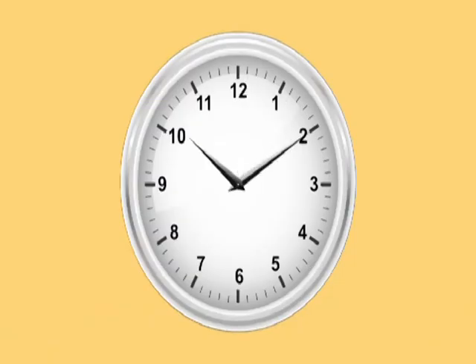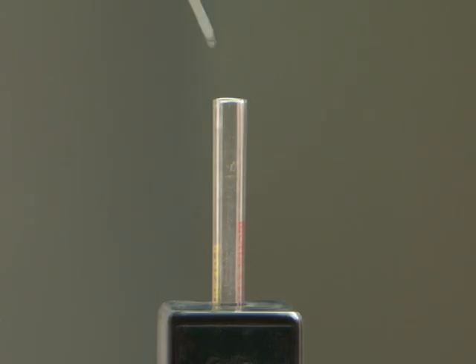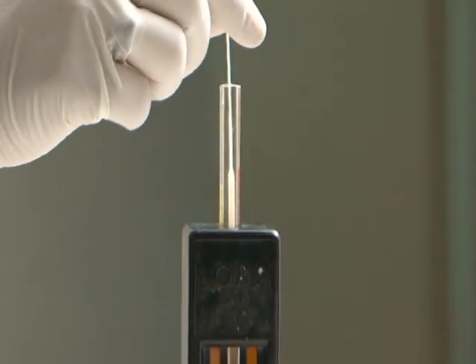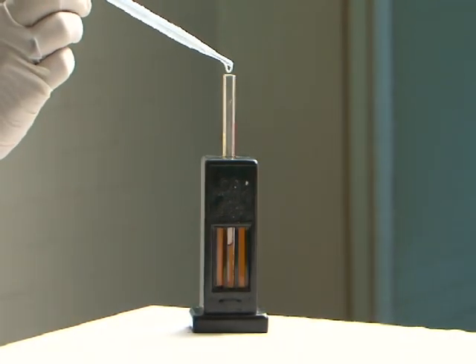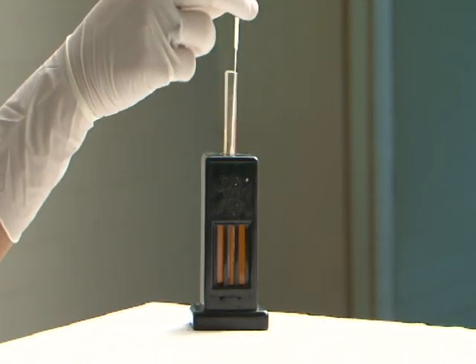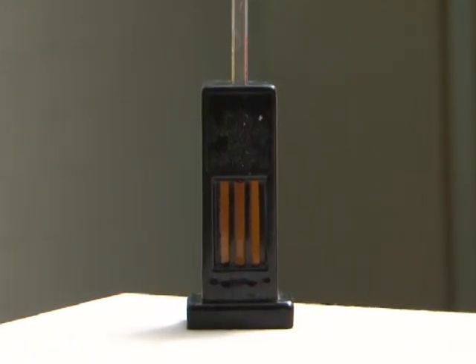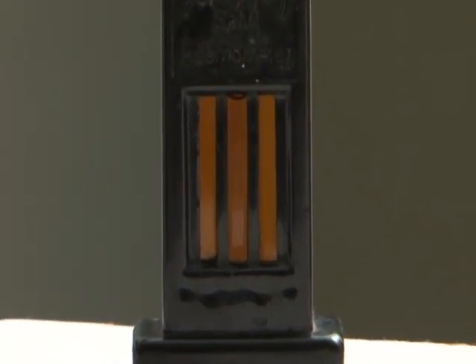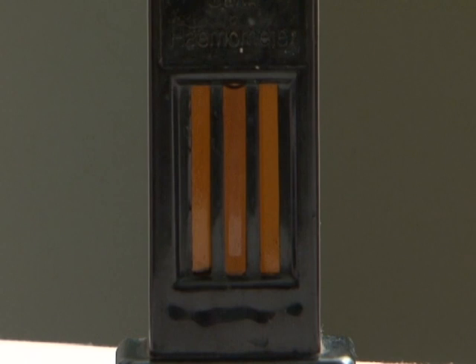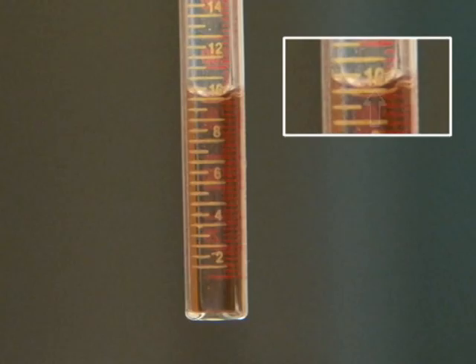After 10 minutes, dilute the acid by adding distilled water drop by drop. Mix it with the stirrer and keep matching the color of the solution with the comparator on both sides of the haemoglobinometer. When the color of the solution exactly matches that of the comparator on both sides, this expresses the haemoglobin content as gram percent. Note down the reading at the lower meniscus.